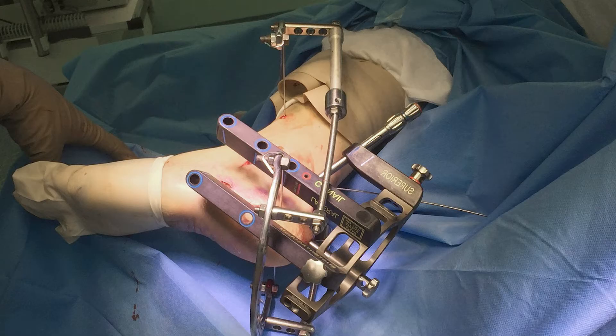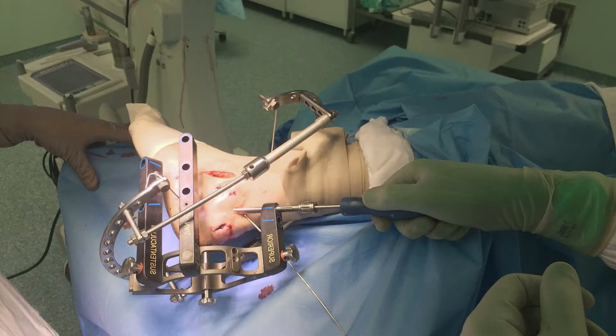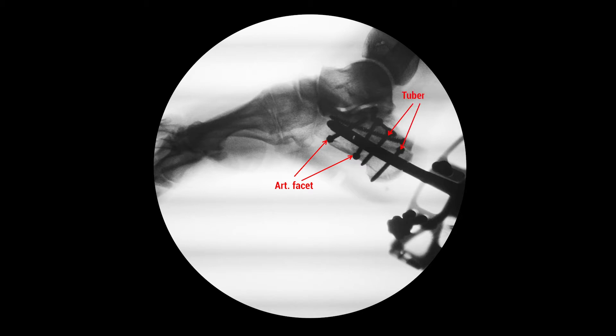After insertion, the nail was locked with five locking screws directed into the sustentaculum tali, calcaneal tuber, and thalamic part of the calcaneus.